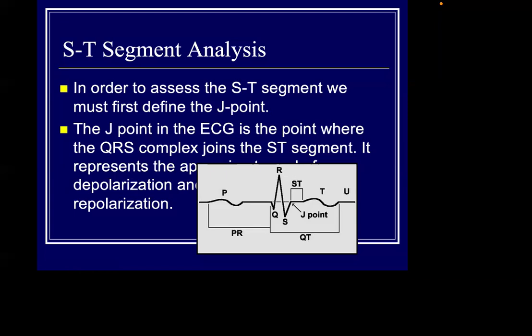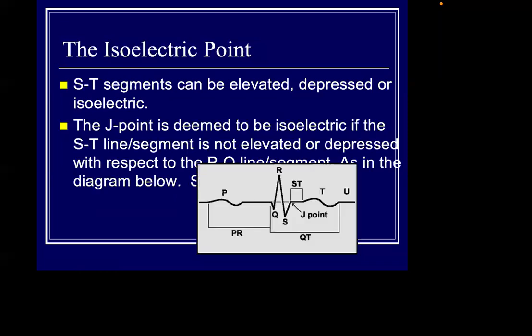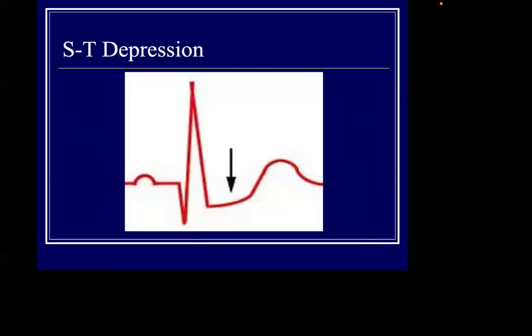And usually, if the blood supply is compromised acutely, you will have shortage in the ATP. And this will be manifested by many abnormalities in the ST changes. So the abnormality in the ST segment, the first abnormality is ST depression.